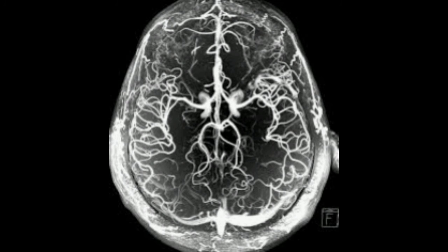This use of angiography as an indirect assessment tool is nowadays obsolete as modern non-invasive diagnostic methods are available to image many kinds of primary intracranial abnormalities directly. It is still widely used, however, for evaluating various types of vascular pathologies within the skull.